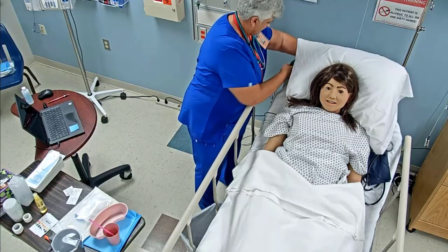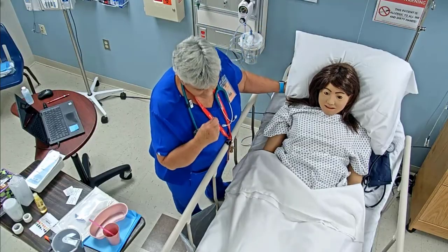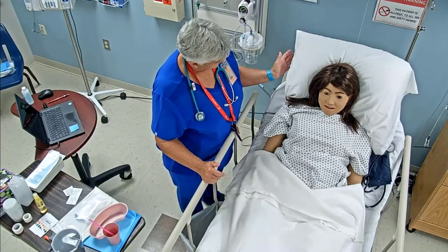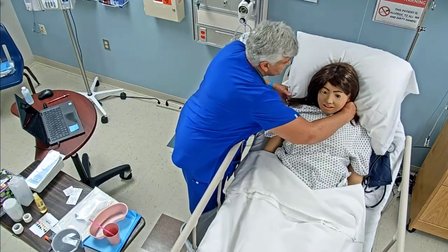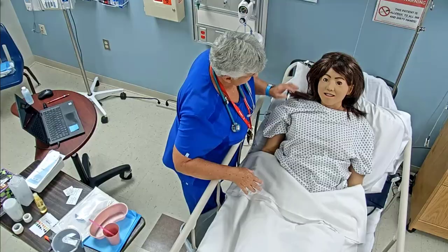Just need to make sure I've got all the wires and stuff. Now when we get through, once we put this NG tube down, we've got to make sure that your head always stays at least at a 30-degree angle. And so I'm going to go ahead and just kind of pull you up a little bit here. And I'm going to put your pillow down just a little bit. Are you comfortable there?